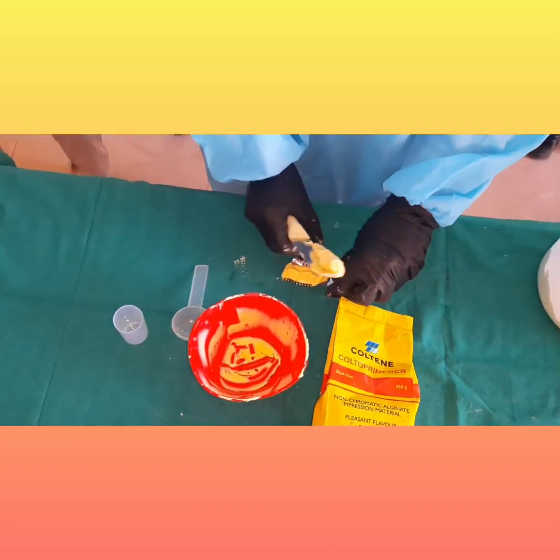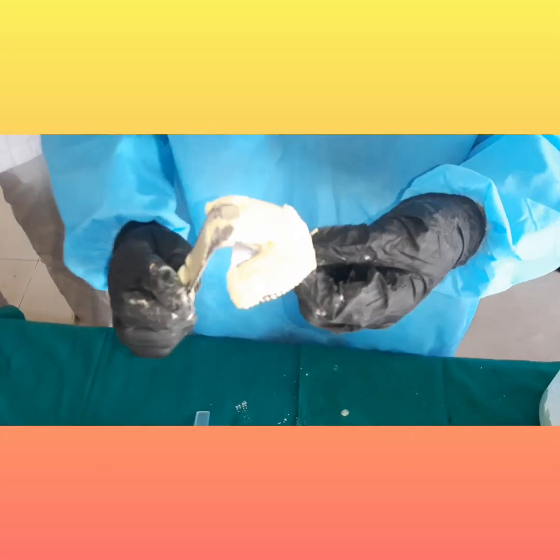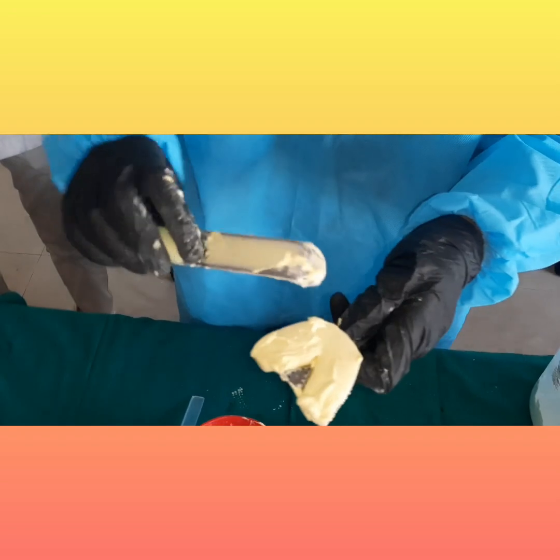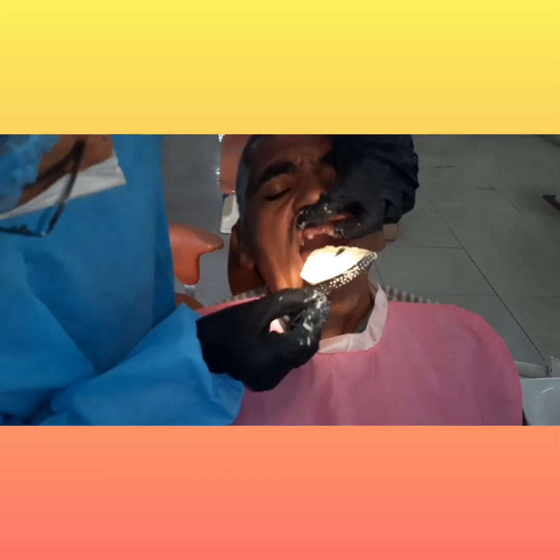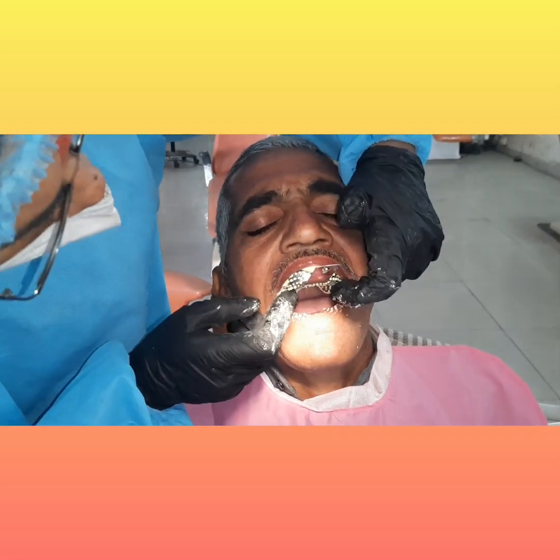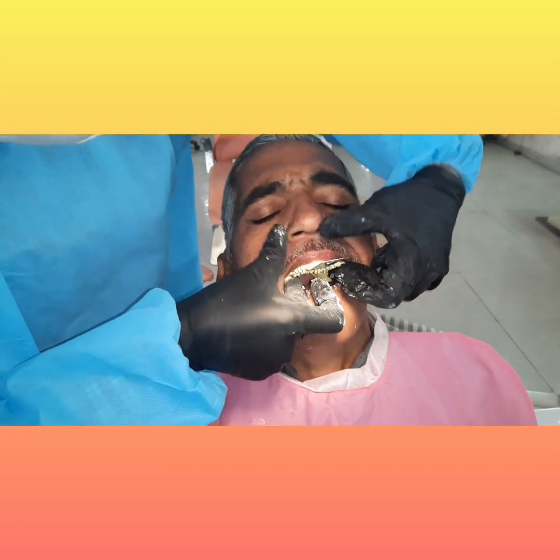Similarly, load the other side. You need not place material at the very back of the tray, because then there will be excess material and it will flow down the throat of the patient. For the upper impression, make sure you do not recline the patient too much. Place the tray in the center — first the anterior part, then the posterior part — and then manipulate.